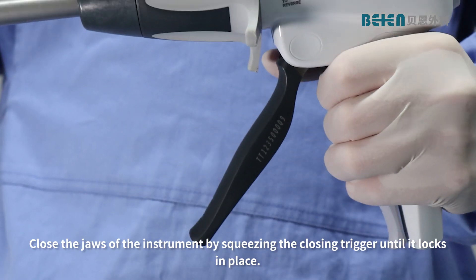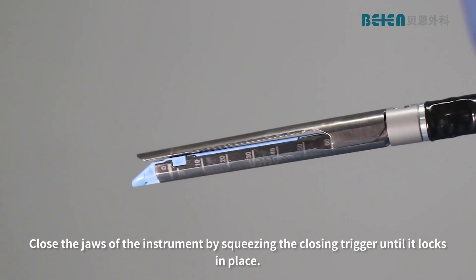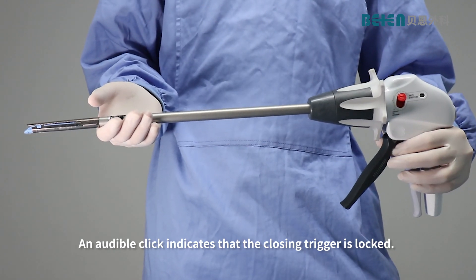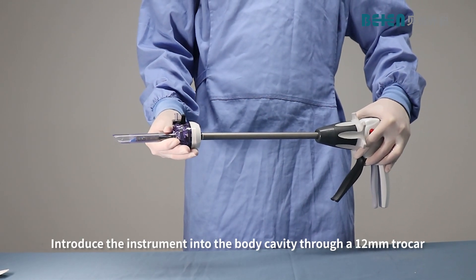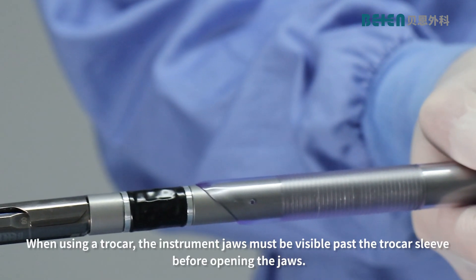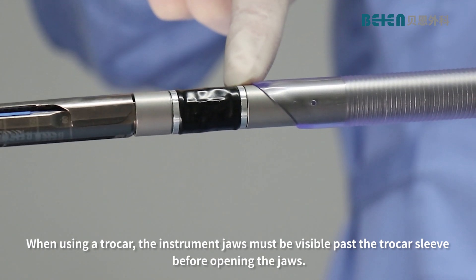Close the jaws of the instrument by squeezing the closing trigger until it locks in place. An audible click indicates that the closing trigger is locked. Introduce the instrument into the body cavity through a 12 mm trocar. The instrument jaws must be visible past the trocar sleeve before opening the jaws.